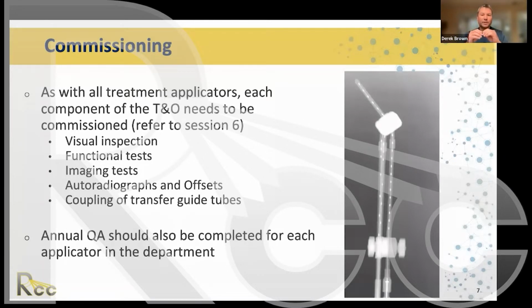So we slowly noticed that the tandem length was getting longer, and the tandem is a piece of metal, so it shouldn't change length at all. Over several months, the tandem went from the expected length to about plus 3 millimeters. And at that point we were thinking, what is going on? How is this possible?